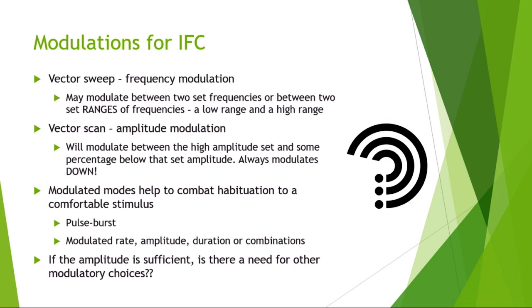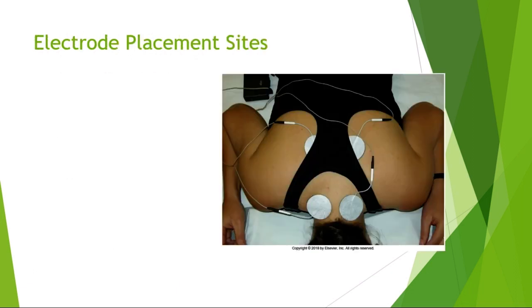And interestingly enough, usually in the clinic you're finding a comfortable but tolerable setting, or strong but tolerable setting, and then you're leaving it on and maybe ramping up the amplitude a little bit each time. But in the lab we really get to experiment, and some students think the modulation is really helpful, and some students say, you know, I like it better without the modulation. So you can try and figure out what you like the best.